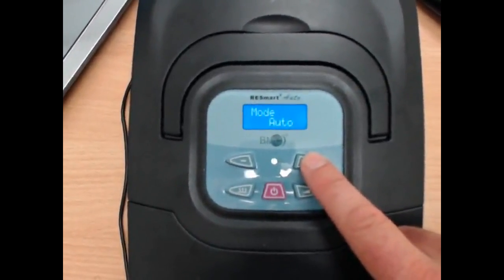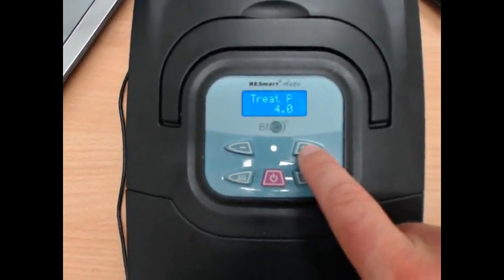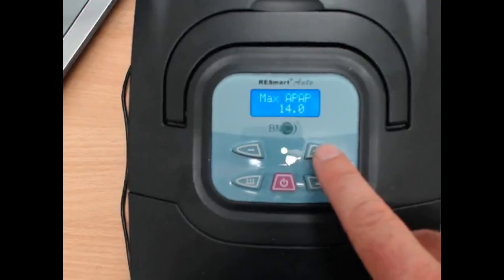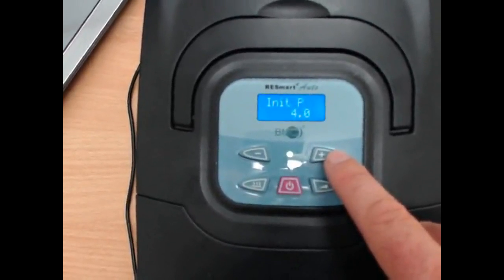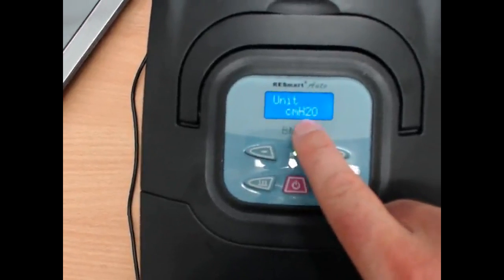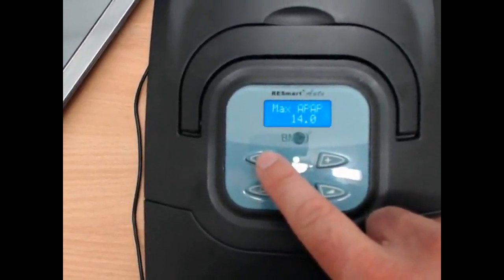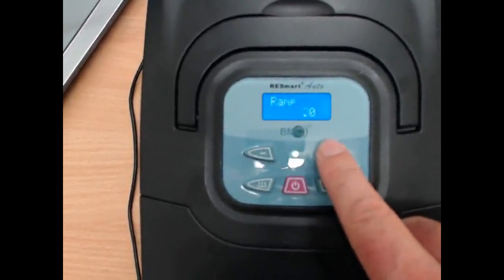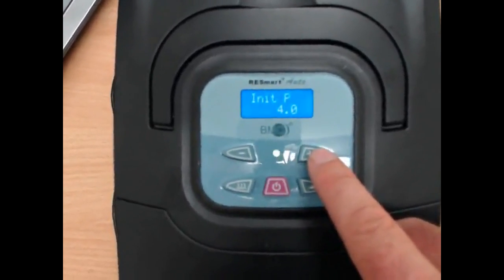Alright, and if I go across now, there's a few bits and pieces. You've got treatment P, which is treatment pressure, max pressure, max automatic positive airway pressure, 14, initial pressure, which is 4. And then after that, you have the units of pressure, which is what we want, cm H2O. So, what does this mean? I'm just going to go back. We've got treatment pressure, max APAP, ramp, and initial pressure 4.